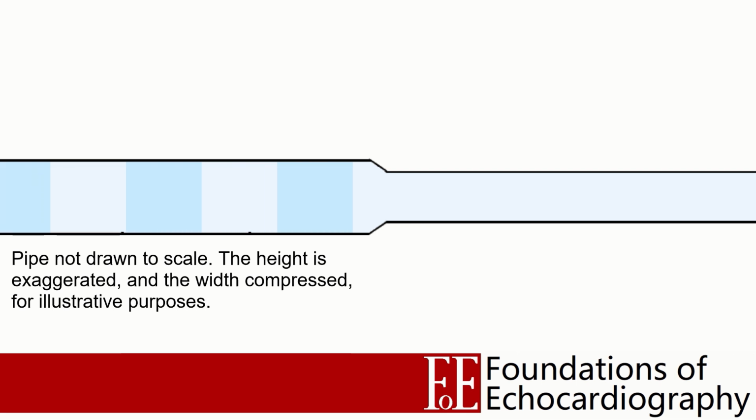As each second another 100 mL of fluid enters our pipe, the fluid needs to move along the pipe at a rate of 31.8 centimeters per second. When we reach the narrowing, the diameter decreases by 30%, such that each centimeter of pipe length can only accommodate 1.54 milliliters of fluid. As the pipe keeps accommodating another 100 mL every second, we need to maintain the same flow rate through our narrower pipe, and therefore the fluid speeds up to a velocity of 65 centimeters per second.